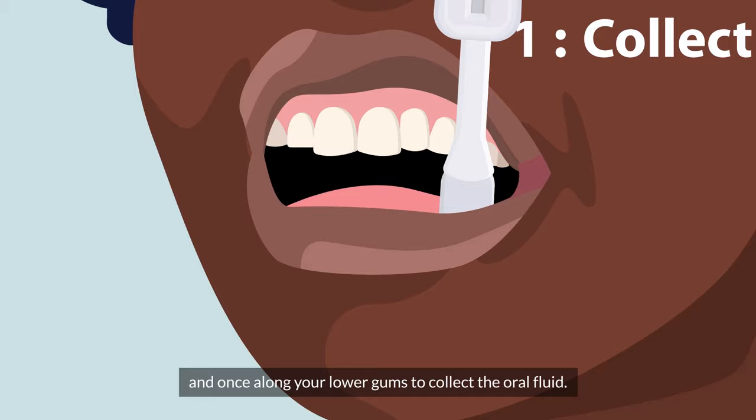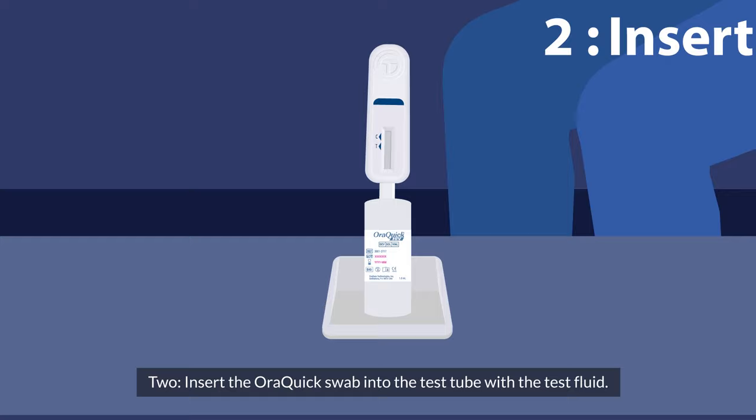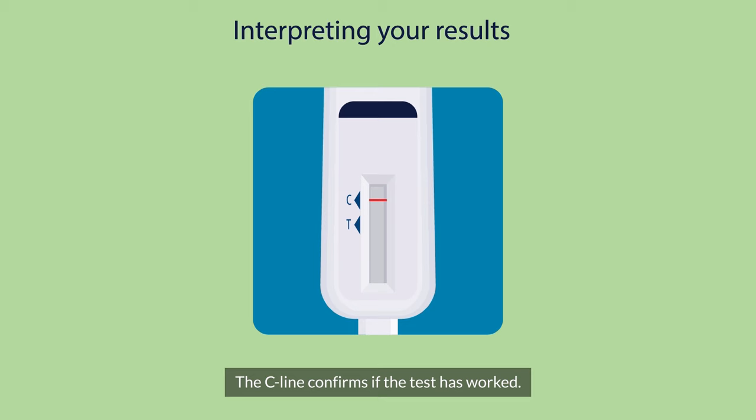Step one: gently swab once along your upper gums and once along your lower gums to collect oral fluid. Step two: insert the OraQuick swab into the test tube with the test fluid.